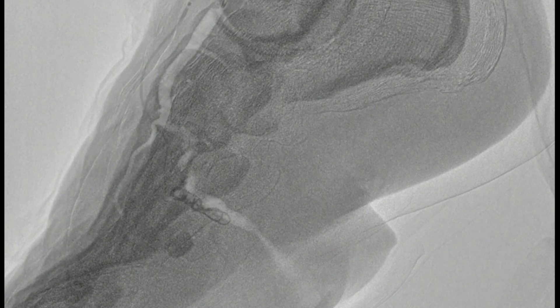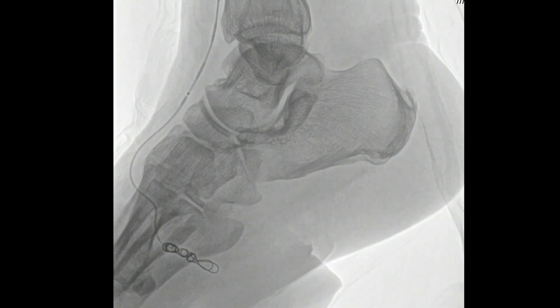We did selective catheterization of that plantar branch and initially placed interlock coils. These are 6mm diameter coils being placed directly into that feeding vessel. We actually start the coil inside the aneurysm and then pull back into position. We used several 6mm coils and then followed that up with some 4mm coils to pack this internally.